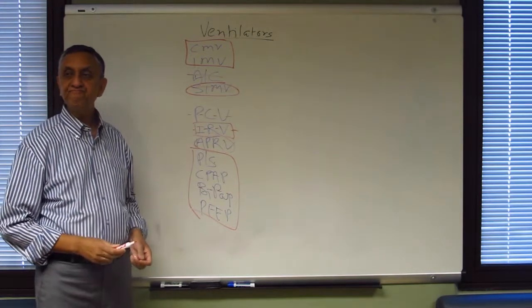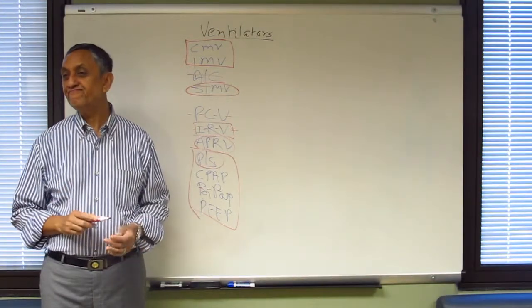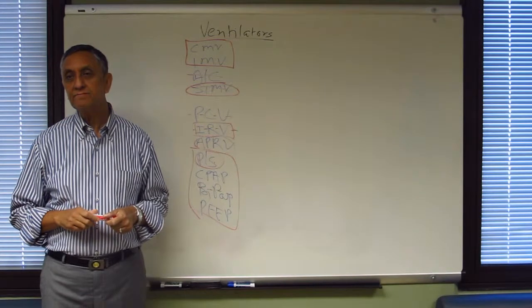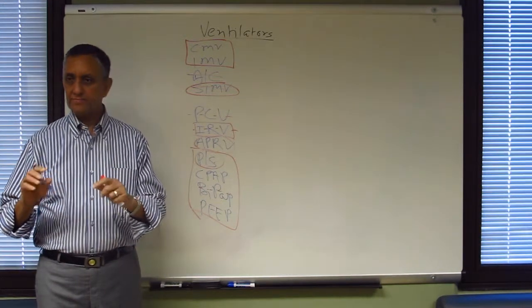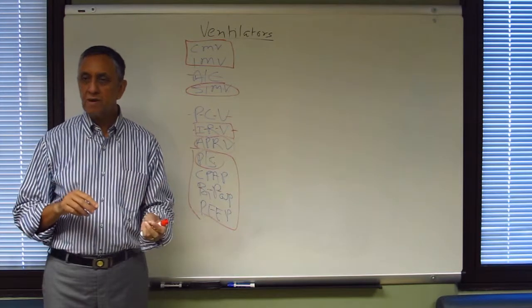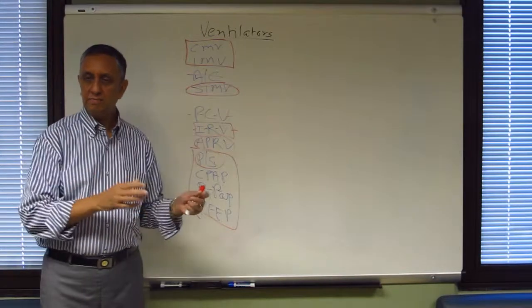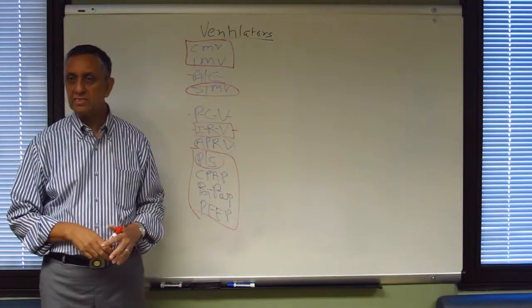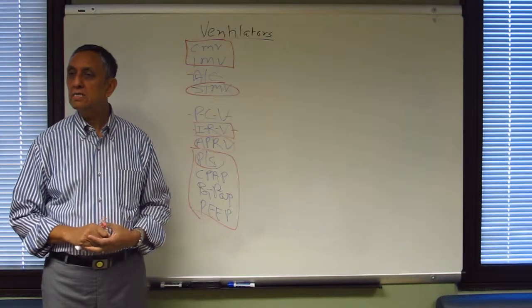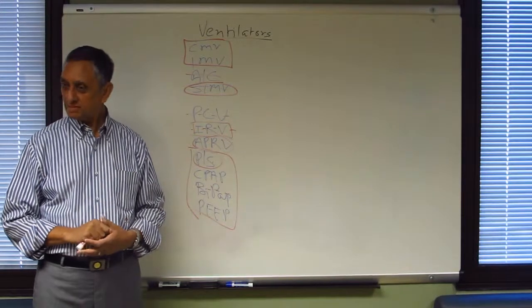Pressure support. How do you define pressure support? I think it's similar to BiPAP. The patient's intubated. No, remember, pressure support can be delivered, so to speak, from BiPAP. But BiPAP consists of both CPAP and pressure support. So it can give support during inspiration as well as expiration. Pressure support, commonly you give it from a ventilator. But what's the definition? In pressure support, it usually requires a spontaneously breathing patient, and upon inspiration, they're given a set pressure support.